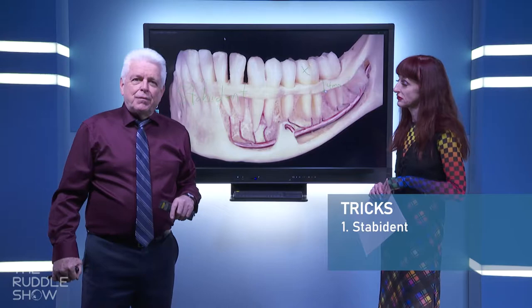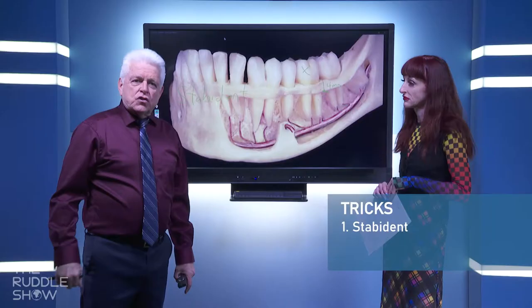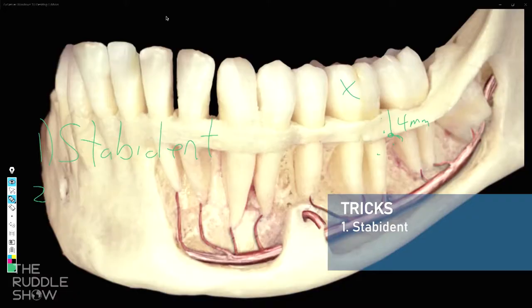People liked it. But the problem was, even though you perforated and there'd be a little bit of blood oozing out, people would come up with their needles and couldn't find the hole because the hole's really small. So a new one came out that I thought was even better, and it's called the X-tip, and it's a trephine with a cannula. So you trephine and pull out your trephine, and it leaves a sleeve inside.